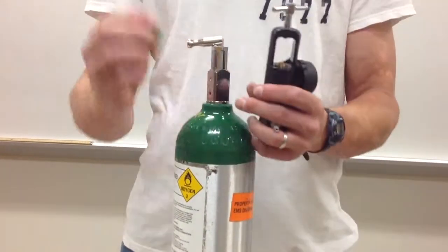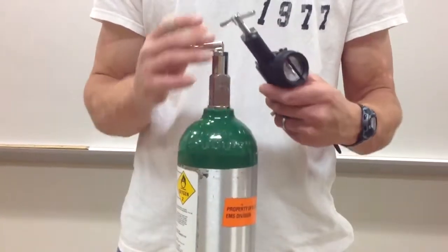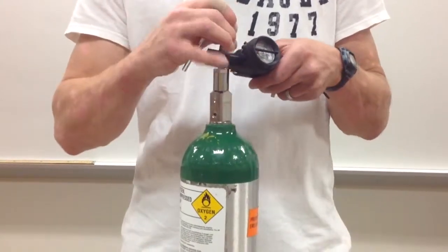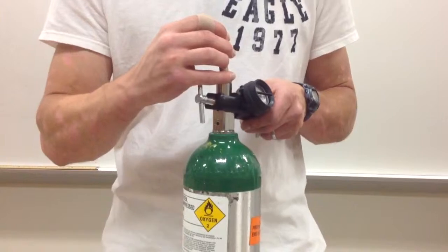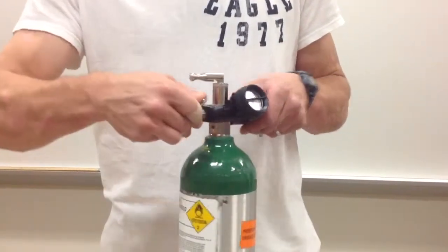Next, position the O-ring onto the regulator. Once in place, the notches on the regulator must line up with the notches that are found on the cylinder. Once in line, begin to tighten the T-screw until it's secure.